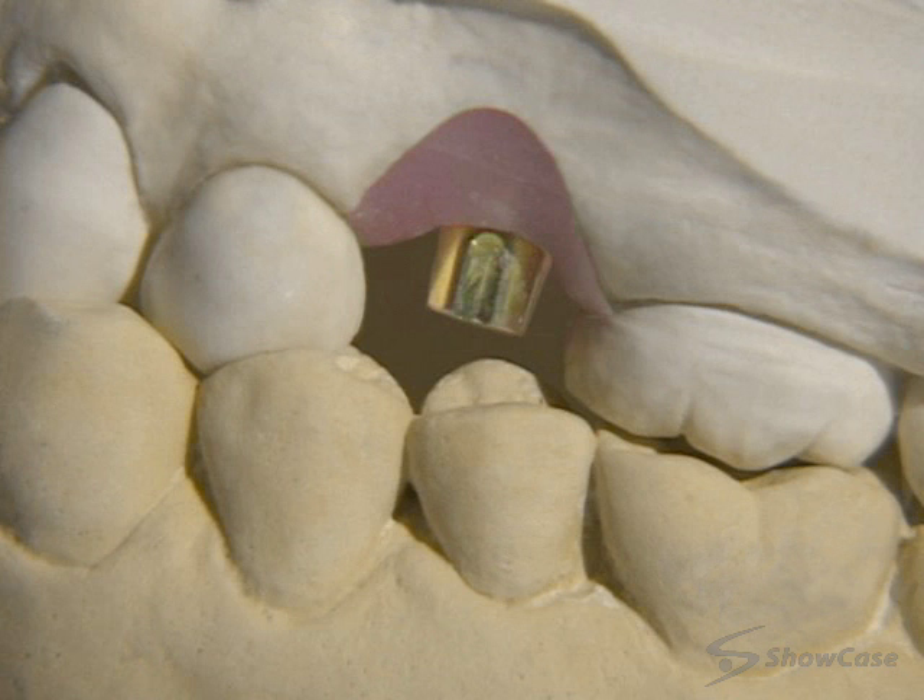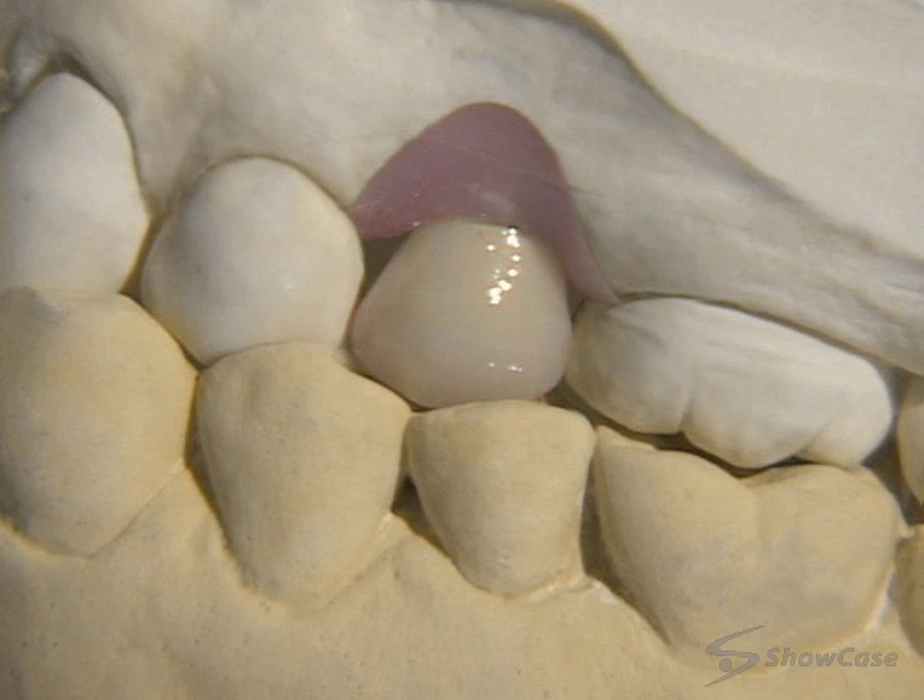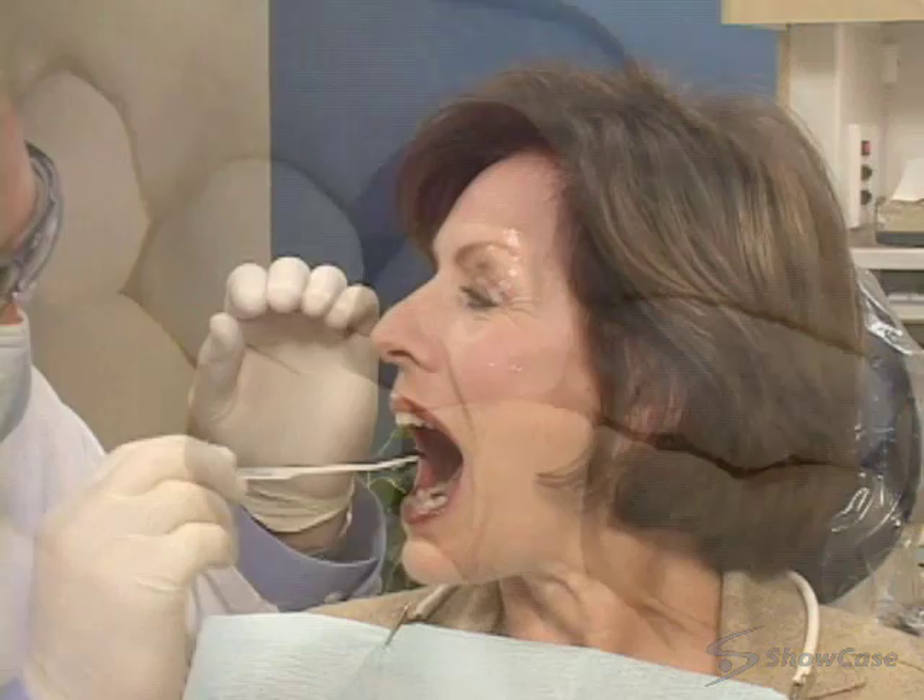They'll use the model to create a restoration that precisely fits the implant and your bite. When it's ready, we'll check the fit and your bite, and then secure your beautiful replacement tooth.